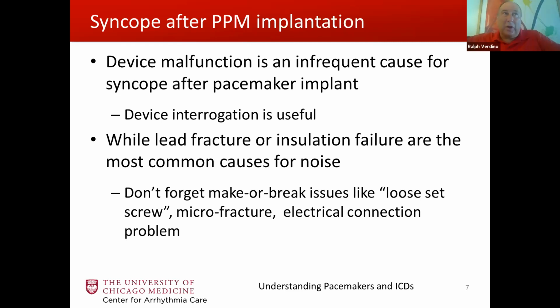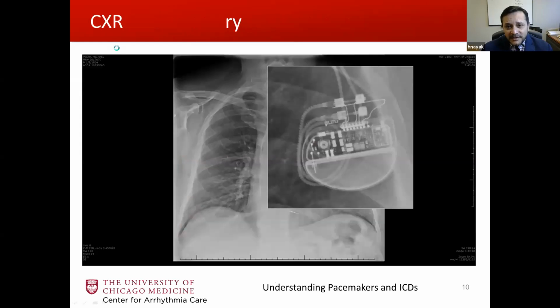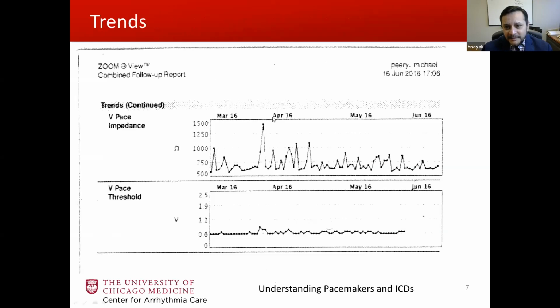That will also cause significant changes in impedance, you think? Well, if you take a look at his trends, there was a little bit of a concern in his trends that something was going on. What I didn't show was his previous trends, but based on his previous interrogations from the other hospital, because he's had routine clinic visits, his impedance was quite steady. And so I didn't think this was a lead fracture. So I took the gamble of keeping the lead in and taking that chance, and he's done well.